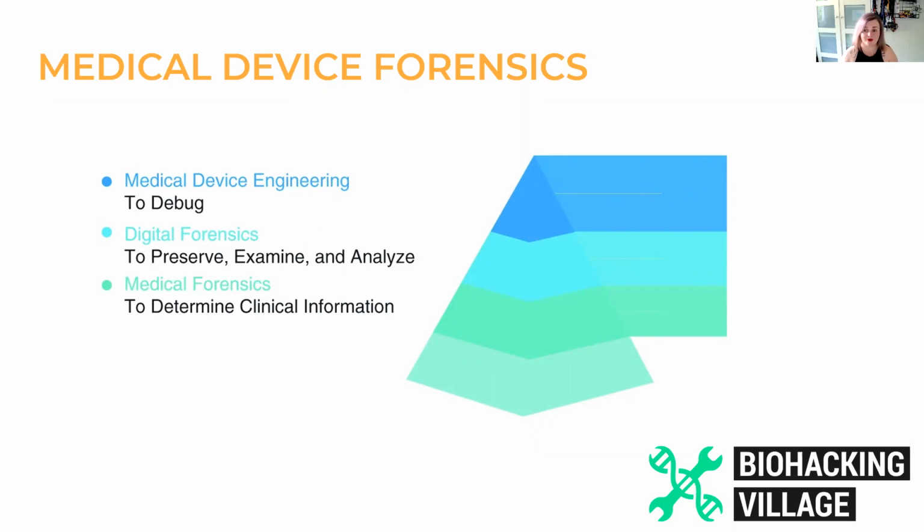Firstly, I wanted to know how it worked mechanically, how it functioned, and that I had to go through a process of debugging. I had to understand and learn how it works. And that kind of falls into the components of medical device engineering, which every manufacturer will be very familiar with. Now, also digital forensics scientific process is one that I've used, and that is kind of, I preserve the information on there. I examine it, I analyze it, I reconstruct a sequence of events. But I also match that up with knowing how the device works.